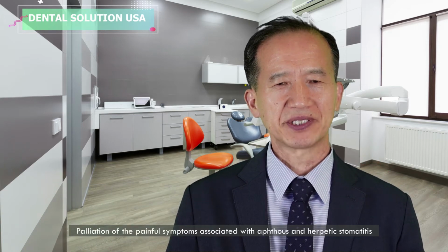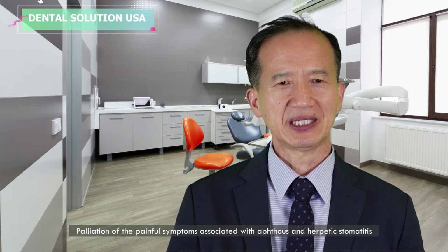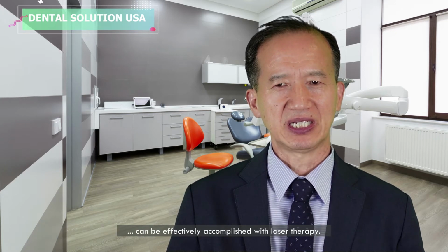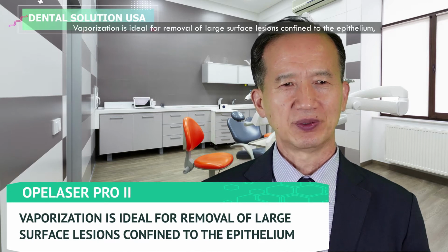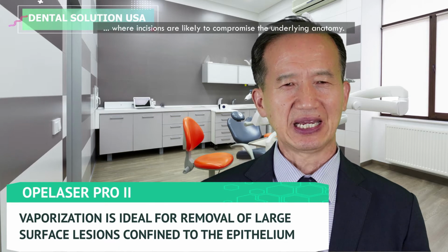Palliation of the painful symptoms associated with aphthous and herpetic stomatitis and treatment of the oral manifestations of acquired immunodeficiency syndrome, AIDS, can be effectively accomplished with laser therapy. Vaporization is ideal for removal of large surface lesions confined to the epithelium located in areas such as the floor of the mouth, where incisions are likely to compromise the underlying anatomy.